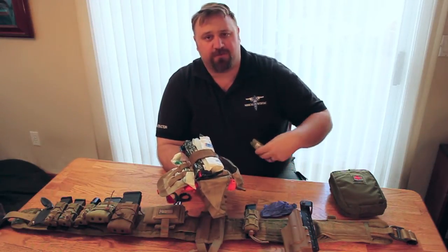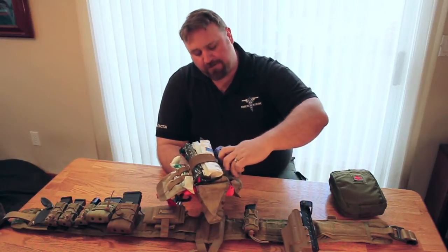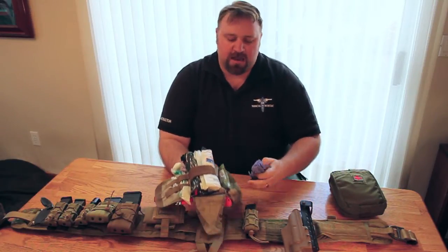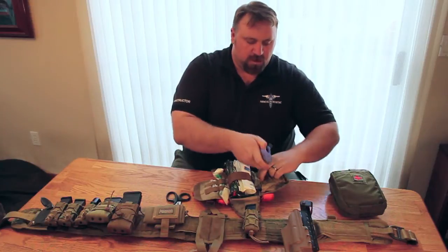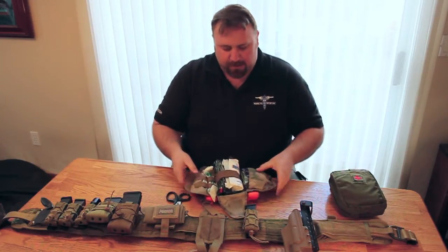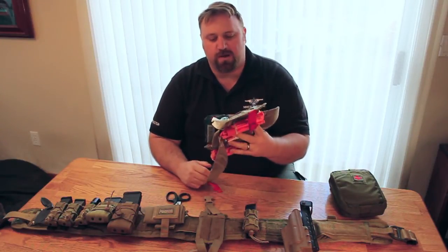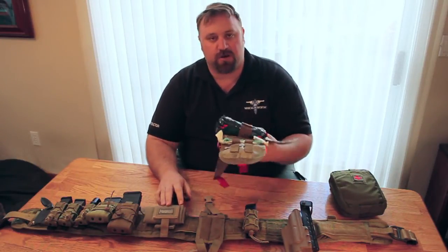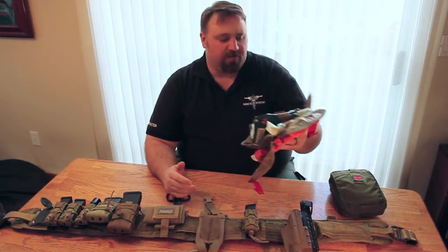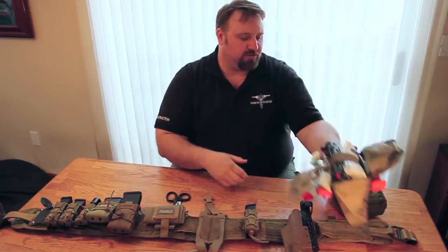We like to put the CPR mask in our kits basically because a lot of the people who are training a lot are going to have a much greater chance to save someone using that than any of the other equipment. It's the perfect size for an individual whether you're training or this is your go-to rig next to your bed. Whatever you're using it for, I prefer this size of the two kits.